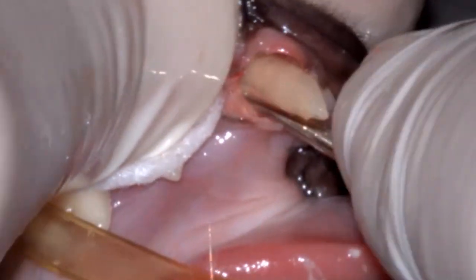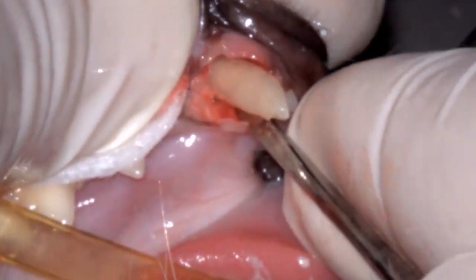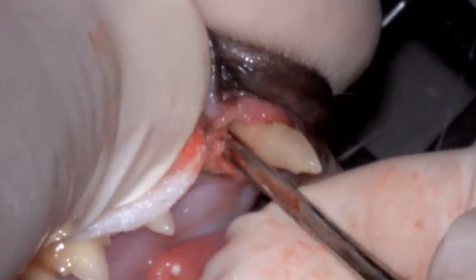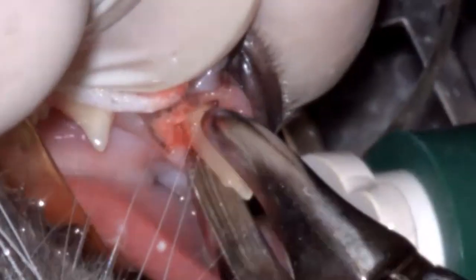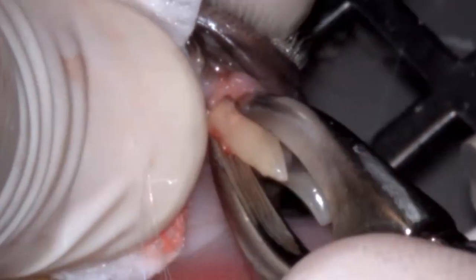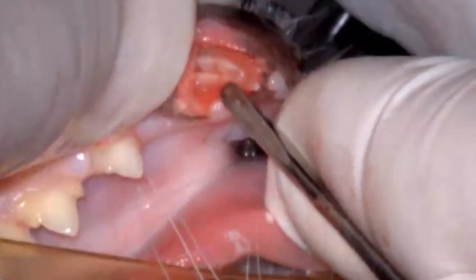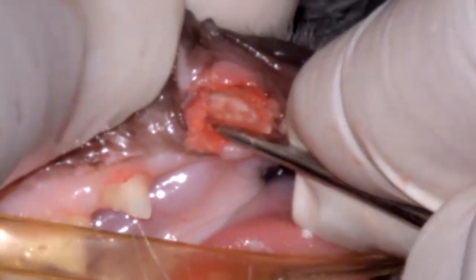Some people would say I could have done this faster by laying back a huge flap initially, removing all the labial alveolar plate, and scooping the root out. I prefer to start conservatively — frequently I'm rewarded and get the tooth out with minimal flap and minimal bone removal, making for a much quicker procedure. If the conservative approach doesn't work, then I get more aggressive. After more bone removal, more moating, more elevation, the forceps are back on and starting to get some movement — but unfortunately all I got out was the crown and about the top half of the root, with much of the root remaining inside the socket. Now we're moving to surgical removal of these root remnants.